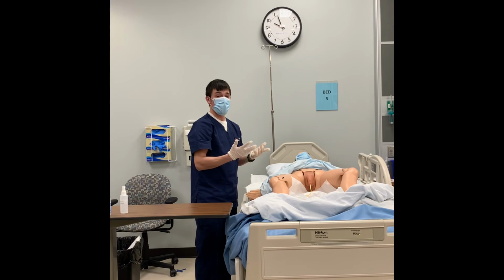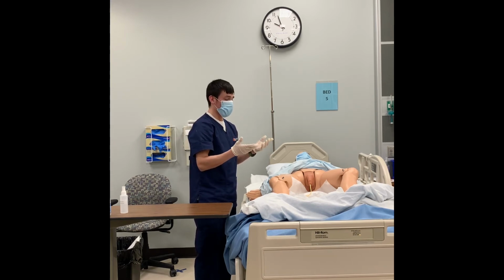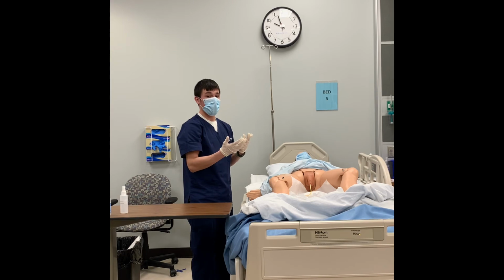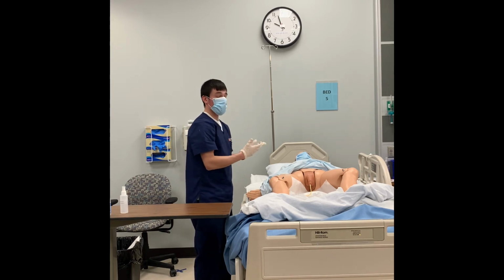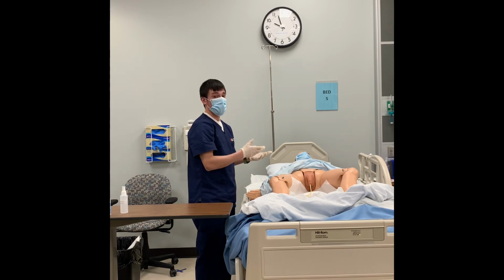A couple days later, or whenever the physician or provider would have the orders to remove the catheter, we would come back in, we would start back over. So I would perform my hand hygiene, talk to the patient, make sure they understand what we are going to do today, and then do patient identifiers, so name, date of birth, double check with the wristband to make sure that we have the correct patient, and then we would go ahead and get started.